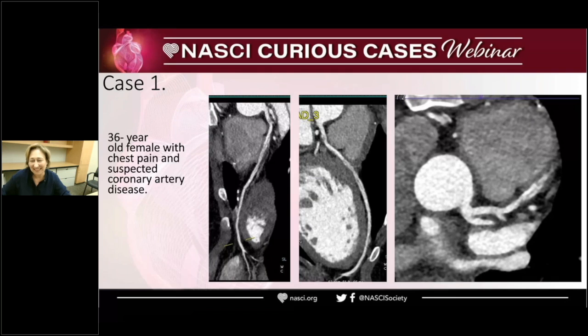Hi, Dr. Frank. Yeah, I can try. So looking at the CT image on the far right, it seems like a very short left main, but otherwise looks pretty good. I don't see significant disease. Maybe in the ostial left main there is mild soft plaque, but nothing too significant. And then in the LAD itself, in the mid LAD, I do see some mixed plaque there, a calcified plus soft plaque. A bit hard to quantify the degree of stenosis, but it looks at least intermediate.